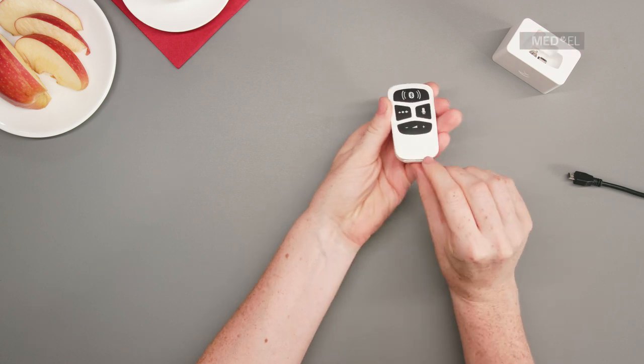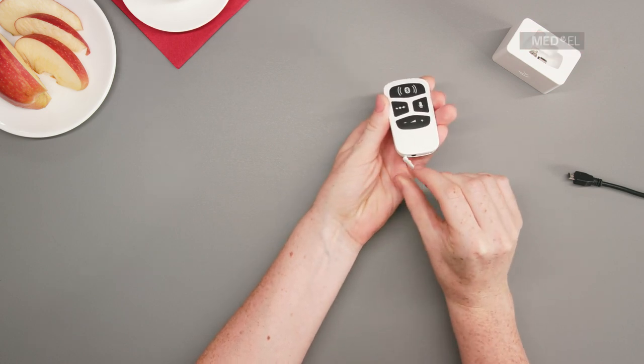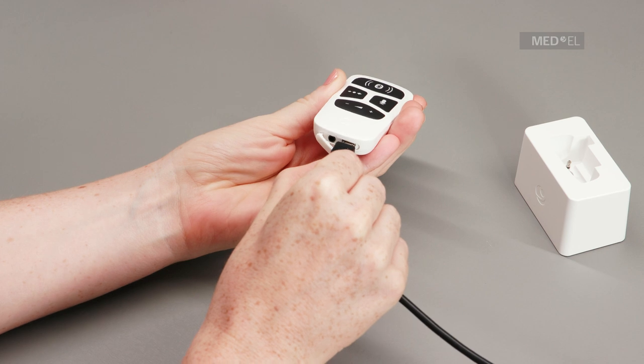To charge AudioLink, open the rubber socket cover. Plug the microUSB cable into the socket.